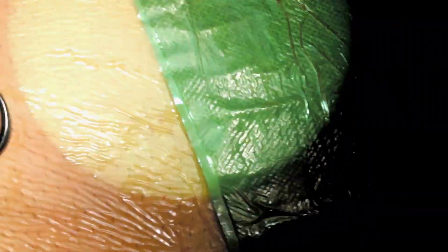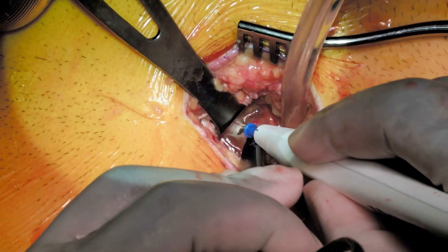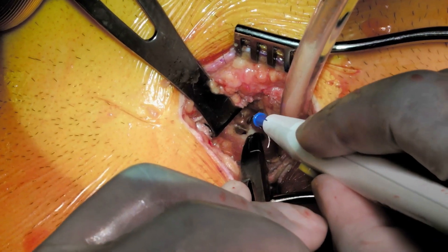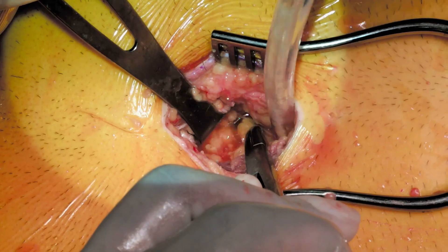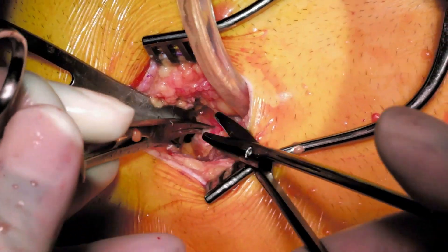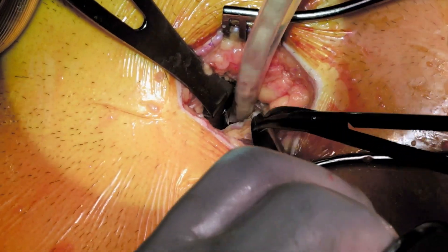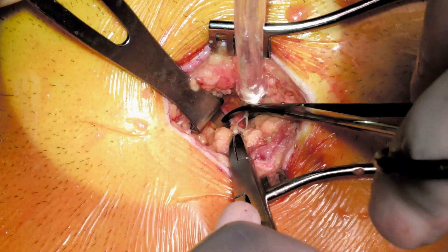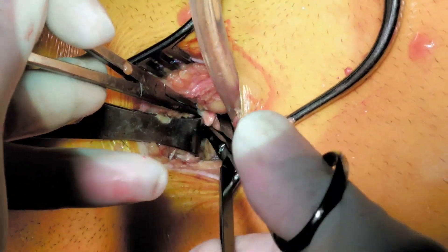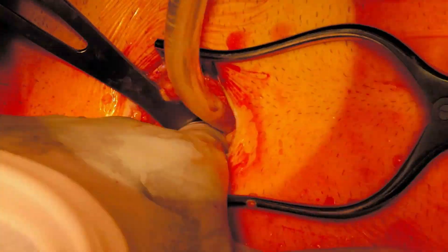I've now drained the majority of the pericardial effusion, but I want to make sure the pericardial window — that actual hole in the pericardium — is as wide as possible. There's fluid around so it's hard to use the electrocautery, so I switch to Metzenbaum scissors to open up that window. The wider the hole is, the less likely fat and other tissues will close it, allowing all the fluid around the heart to be absorbed by the body.